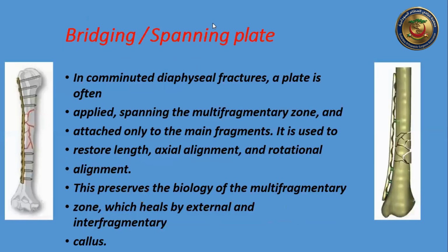The most important function is stretching and spanning, the bridging plate, which is very important. Before we go deeper, there are many concepts that should be known. It's used in comminuted diaphyseal fractures. The plate is applied only to the main fragments and spans the comminuted fragmented area. There is no screw in the fragmented comminuted area.